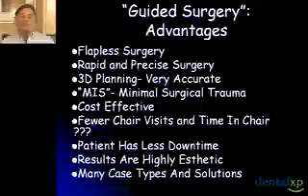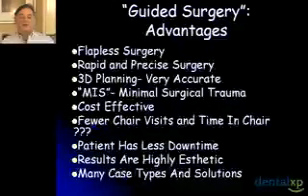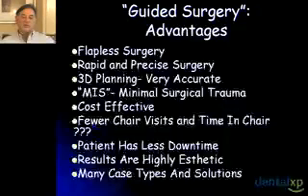MIS, or minimally invasive surgery, allows us minimal surgical trauma. I find it to be tremendously cost-effective because the time to place each implant is minimized. We have one surgical template, and we can use it for several implants at the same time. The patient has the same exact number of surgical visits in the preoperative steps. If you do teeth in an hour, we are done at the final restoration. They do, in fact, have less chair time.